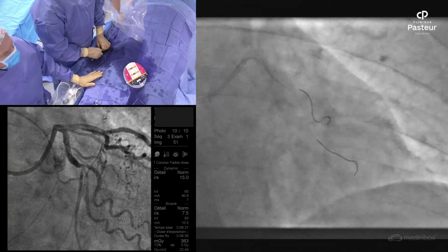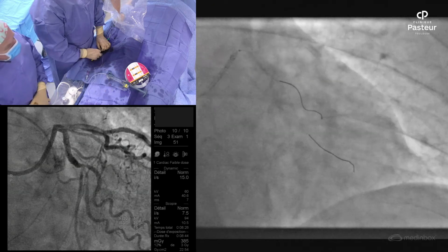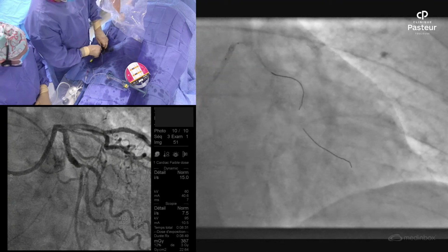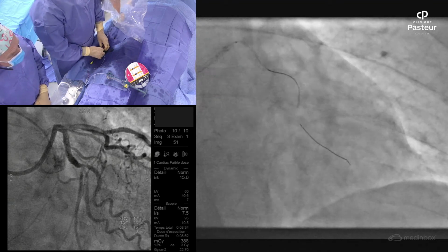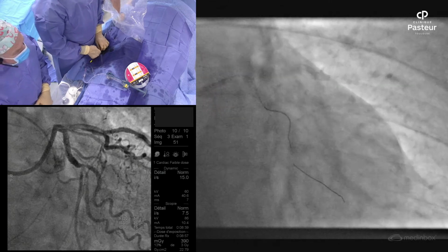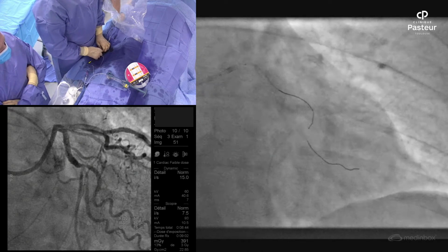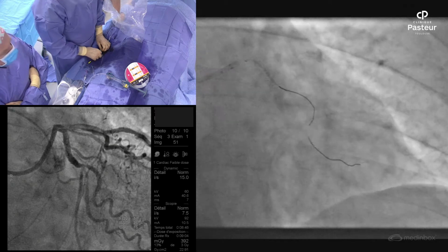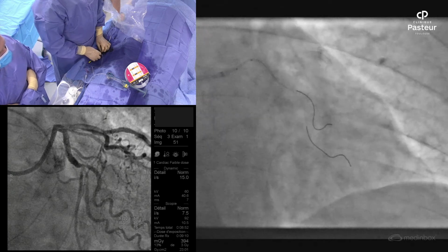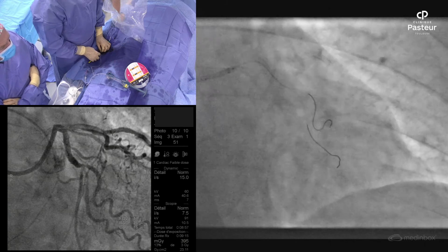There was a comment about pulling back the guiding catheter. It could be helpful, especially when we advance the balloon or the stent. And you see, that's a difficulty. I pulled the guiding, but maybe the wire was through the struts. If I cannot advance the 2.5 balloon, it's certainly that we have it through the wire, so we have to replace it. Probably, yeah. That's a good comment.